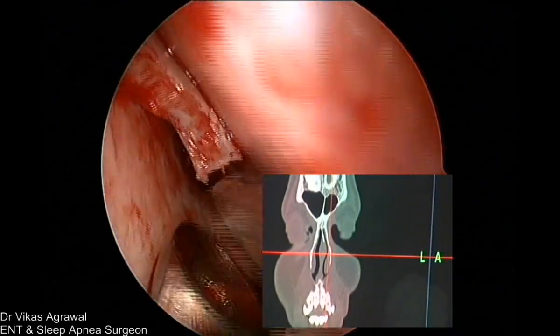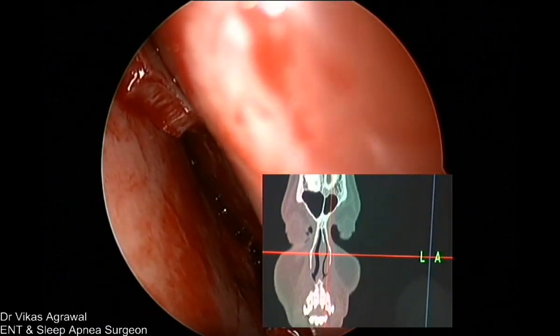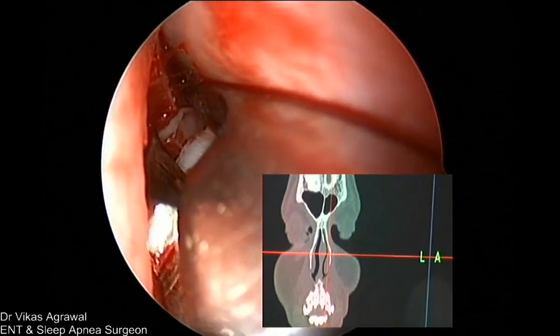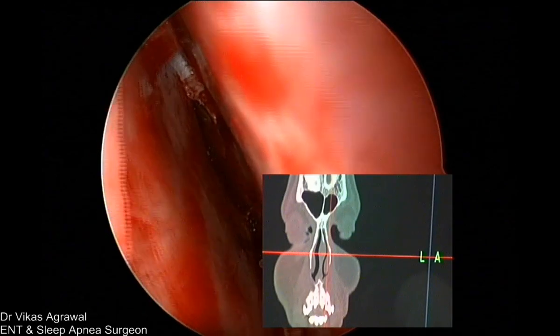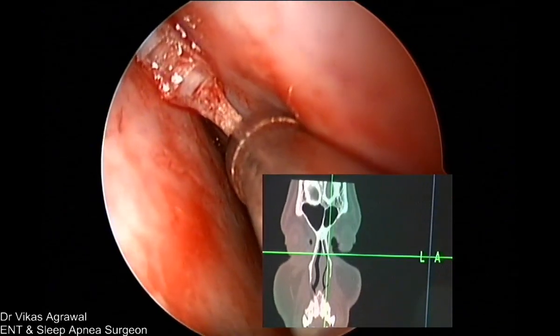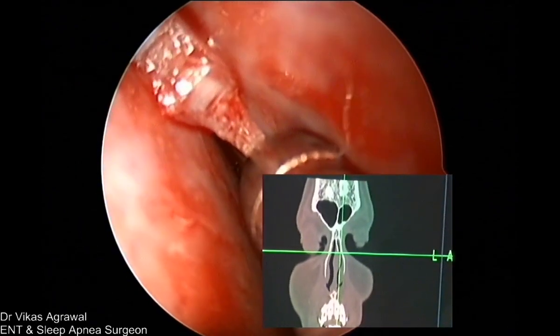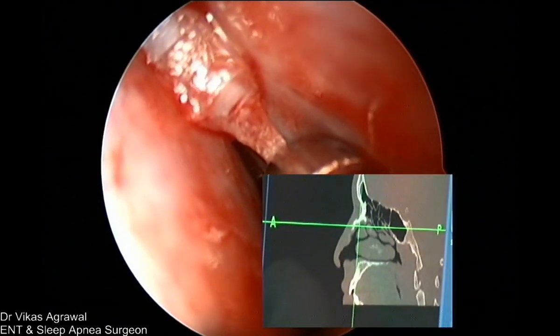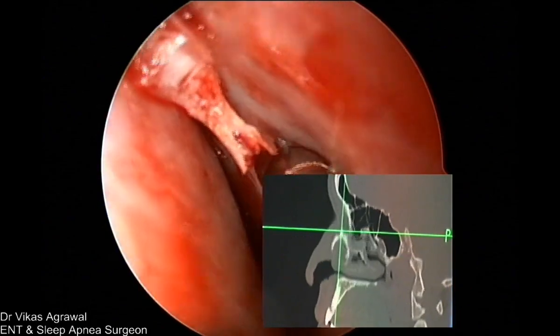You have no problems in removing it. On the scan, you know that we are very, very low. So you can simply remove it without any fear. The moment you remove it, now again I'll show you. That's the bone. Now see where is that bone. Show on the coronal. Coronal you are showing, right? Show on the sagittal now. See sagittal, how low we are. We are well miles and miles below the skull base, right?